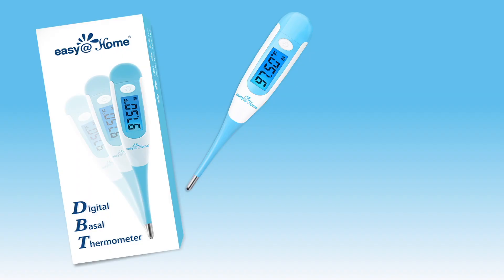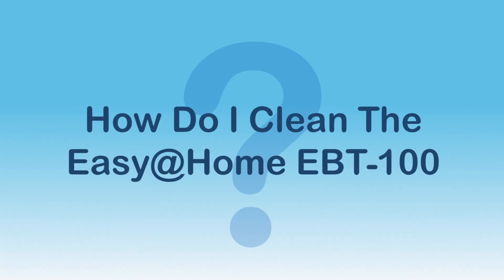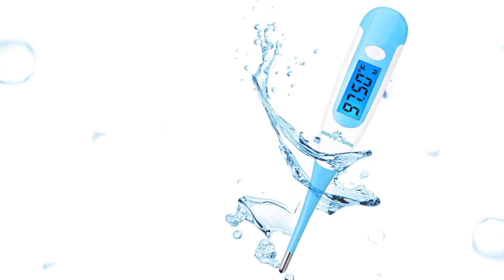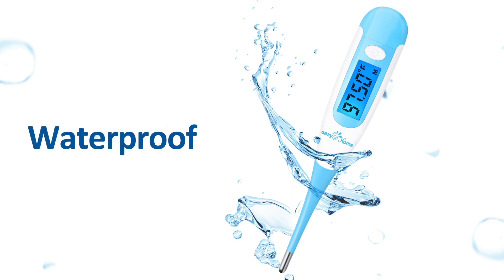Your thermometer comes with a storage case, a spare battery, and a user manual. Once you finish your measurement, you should turn it off and clean the thermometer. The best way to clean the thermometer tip is by applying a disinfectant such as 70% ethyl alcohol to a damp cloth.